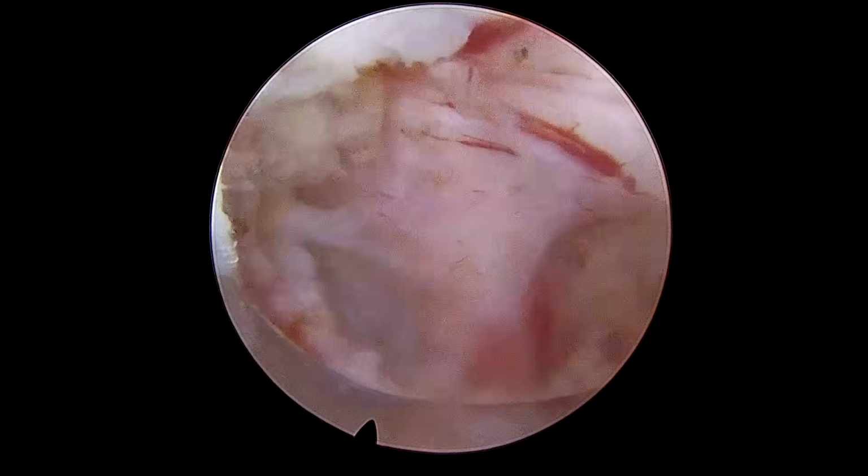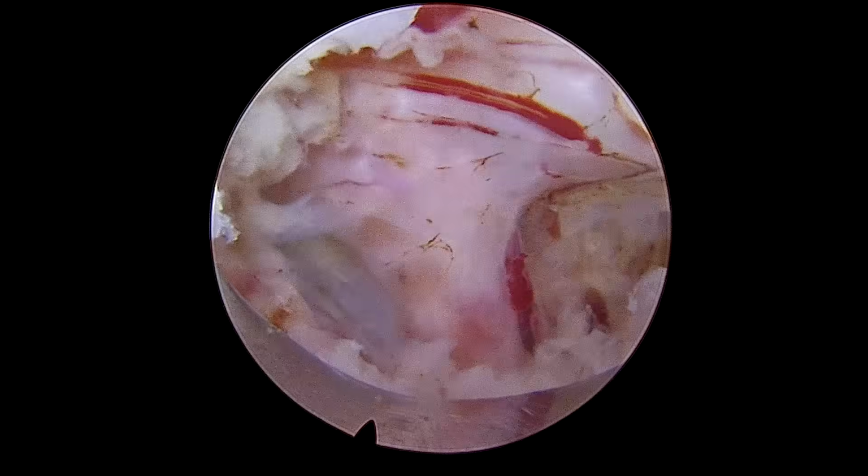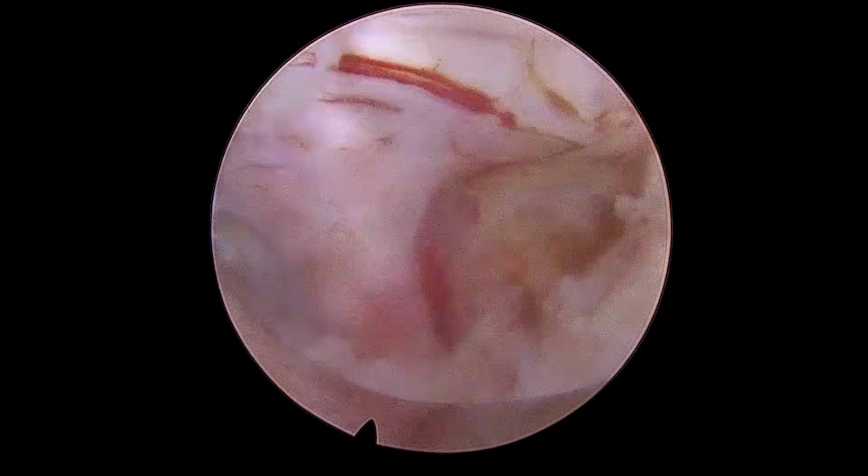So here is the image after complete decompression and complete removal of the sequestrated fragment. The root is completely free. There is no active bleeding. I think this patient will do very well.